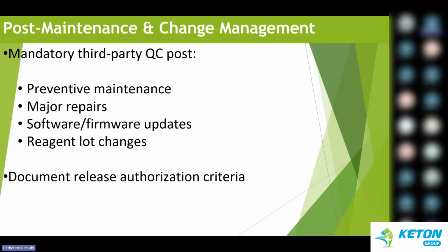Then maintenance and change management: post-maintenance and change management checks must be done after any change to the analyzers and reagents before releasing patient results. That one we had mentioned, that it is mandatory. Always run third-party QCs after major changes, for example after PPMs, after repairs, or after software upgrades. We want to ensure that you're running QCs, and then you release results only when QC is acceptable.